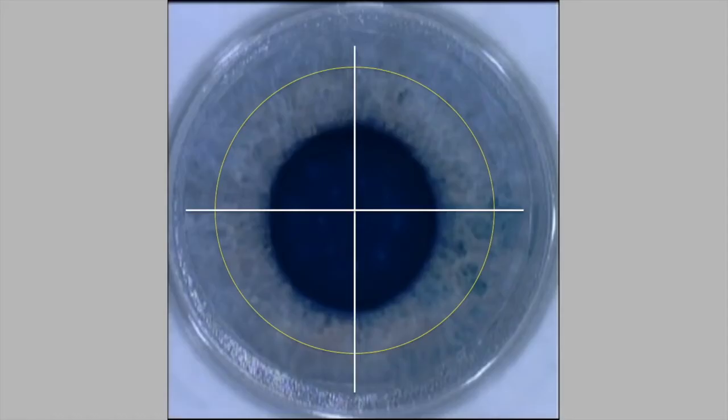Minimizing applanation pressure to help reduce problems with OVL. Your task then is to make sure that the applanation meniscus, which you can see here under the glass, is concentric with the yellow flap edge guide marker on the Intralase screen before you release the squeeze on the interface handle, locking the applanation. That helps to reduce problems with parallax error.